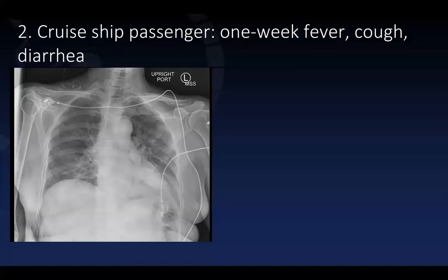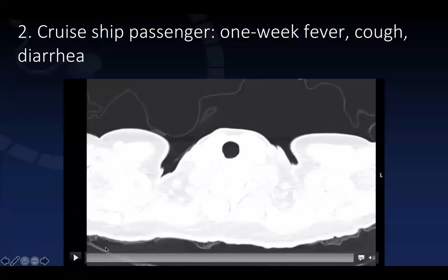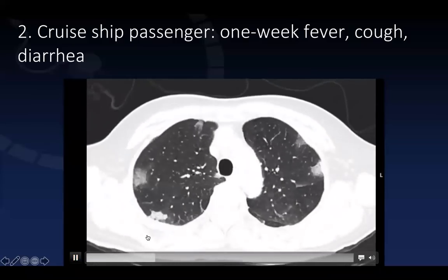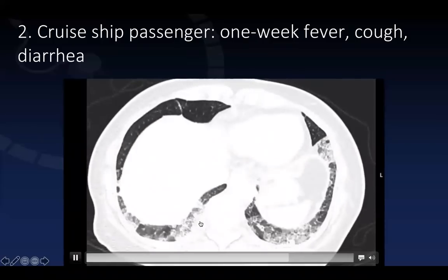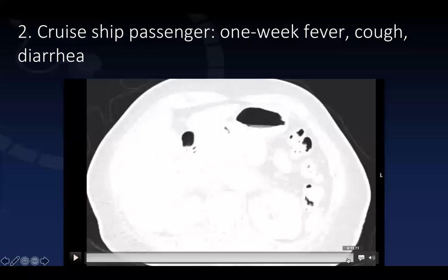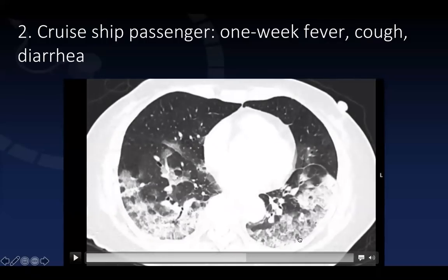The next patient is a cruise ship passenger with one week of fever, cough, and diarrhea who had been quarantined. You can see patchy areas of ill-defined opacities on the chest x-ray, and three days later there is progression with increased ill-defined opacities. On CT, scrolling through, one sees peripheral areas of patchy ground glass and more consolidated opacities. As we get toward the lung bases, you can actually see crazy paving — the sign combining ground glass with inter- and intralobular septal thickening — most evident in the dependent aspect of the left lower lobe.